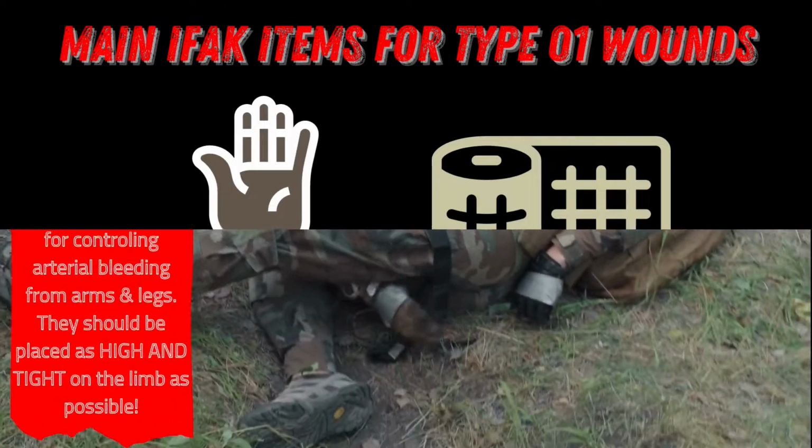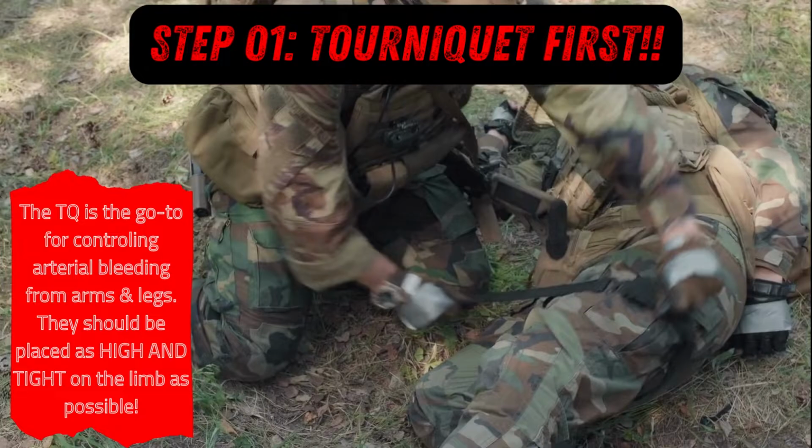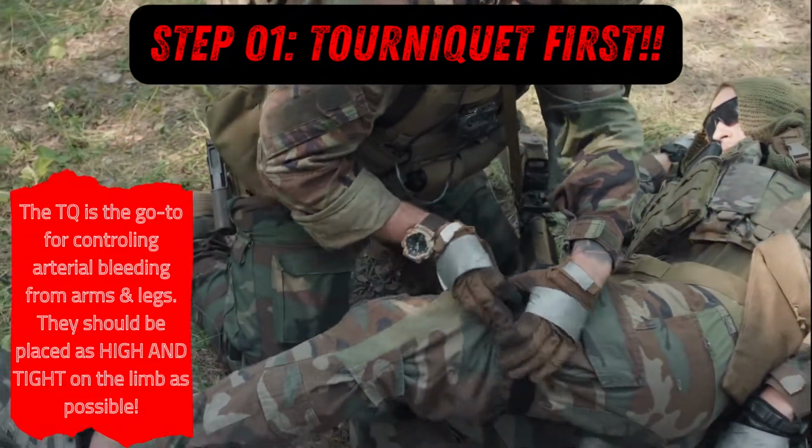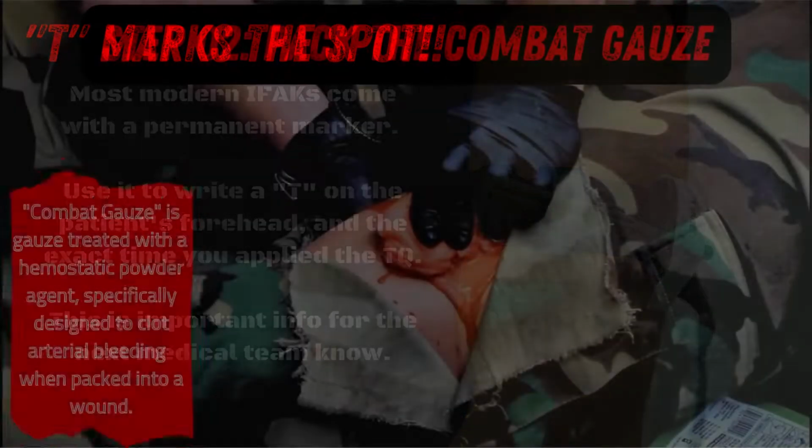Our primary tools in this case will be our blood stoppers, a tourniquet, and hemostatic gauze, aka combat gauze. A tourniquet is a hook and loop strap with a tightening rod attached to it. It should be placed as high and tight on the limb as possible. Most modern IFAKs come with a permanent marker, so use it to write a T on the patient's forehead, along with the time that the tourniquet was placed.